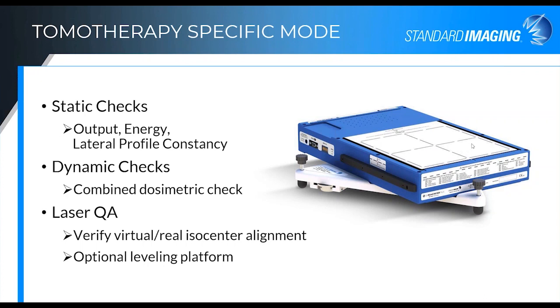You could then deliver a static beam in the TomoDirect mode, and the device will measure lateral profile constancy and energy and output value for you. Or you could also actually do a treatment plan similar to a dynamic mode and deliver beams to 3 different ionization chambers, and all of those are available for you. In addition, there are some alignment marks for the laser and isocenter alignment verification as well.